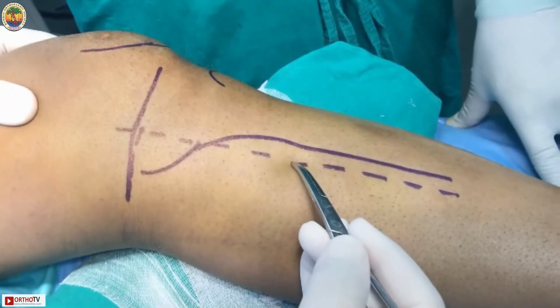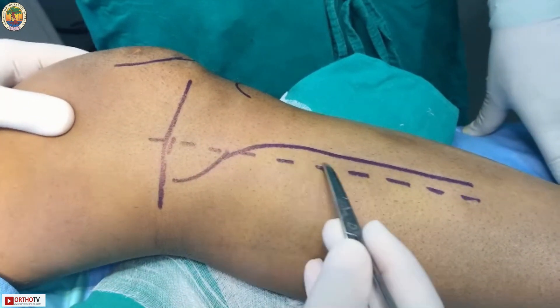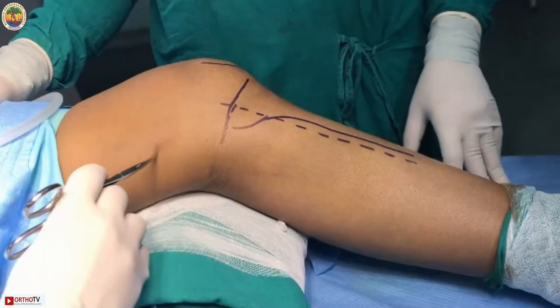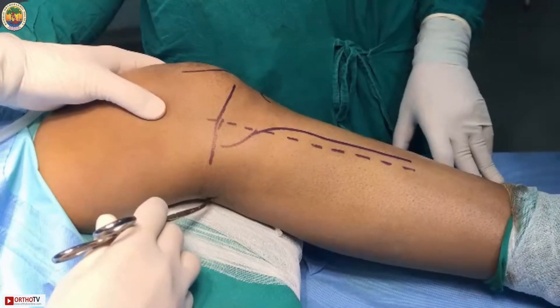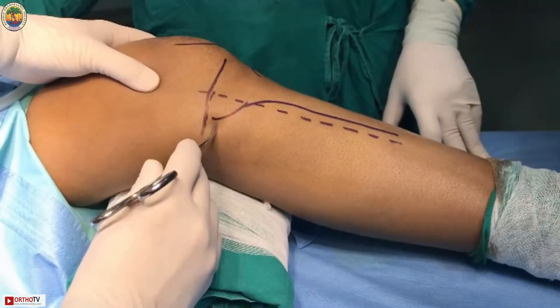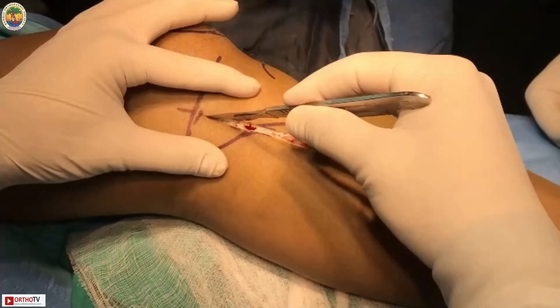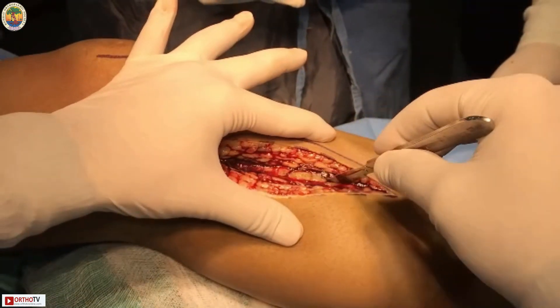The incision is made one centimeter posterior to the posterior medial border of the tibia, going vertically just above the joint line, with extension as needed for the fracture. The knee is flexed by around 25 to 30 degrees so the neurovascular bundle moves posteriorly, allowing easy access to the posterior condyle of the tibia. The incision is taken through subcutaneous tissue with no important structures in this area.